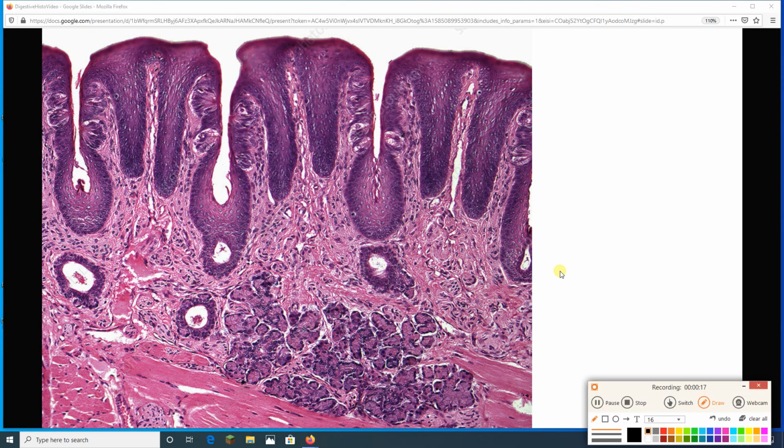All right. What I want you to notice, first of all, are these. Let's use yellow. These rectangular blocky things. That's not the technical term. Each of these rectangular blocky things is a lingual, because it's on the tongue, that's what the word lingual means, a lingual papilla. Papilla just means a bump. So this is a lingual papilla. Each of these blocky things is a lingual papilla.